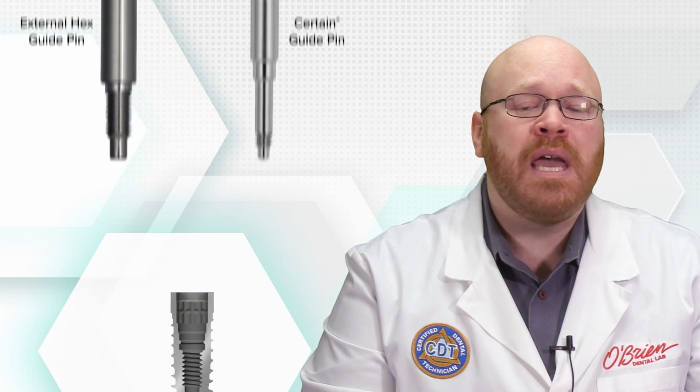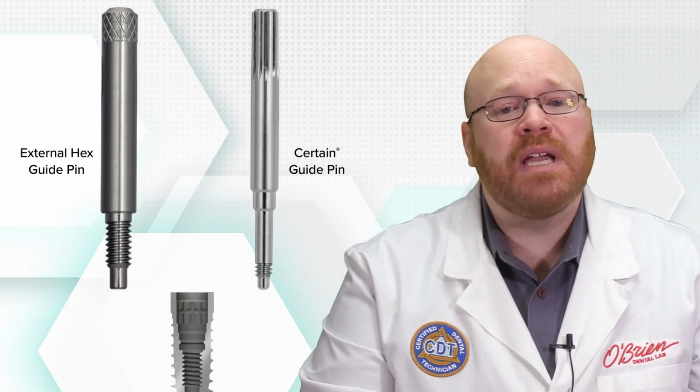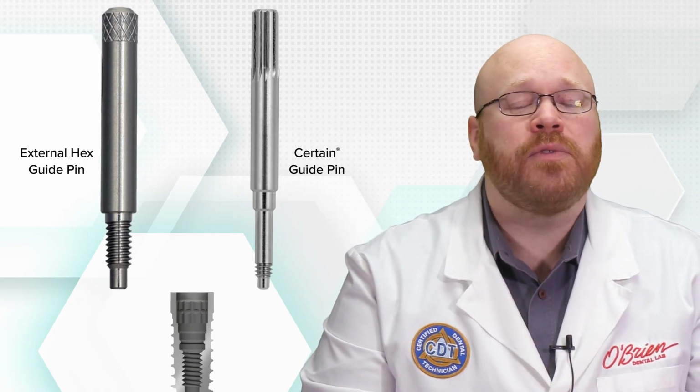Once you've removed the broken screw, you should check the integrity of the internal threads of the implant. This can be done with the guide pin that is included with the kit. If the guide pin does not easily thread into the implant, it's possible that the internal threads are damaged. Verify that the implant is completely clean and free of debris, and if the guide pin still can't easily be inserted into the implant, it may need to be removed.